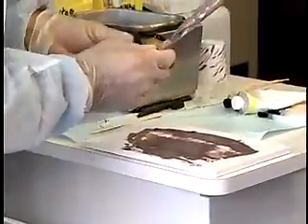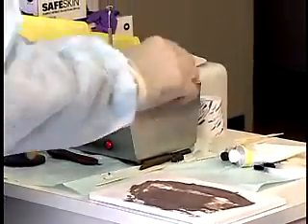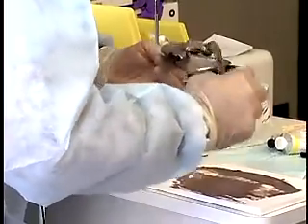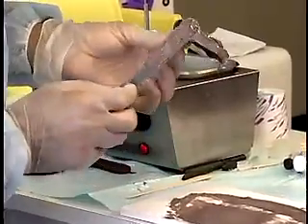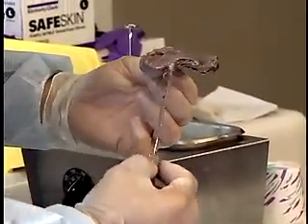Distribute the material uniformly in the tray using a small cement spatula. Over the borders 2 to 3 mm into the labial and buccal surface of the tray. Place only enough impression material in the posterior of the tray to record the tissues. Excess material will flow out of the posterior of the tray and cause the patient to gag.